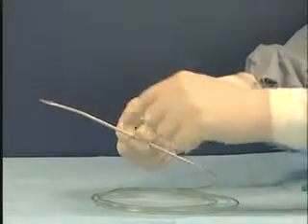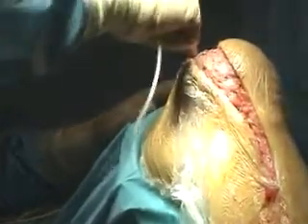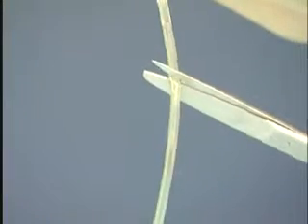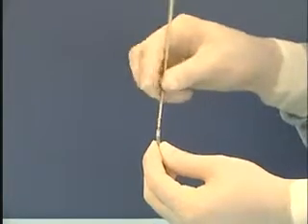We insert and pass the trocar wound tubing into the desired location until the black line indicators appear just outside the skin surface. We make sure that the section of wound tubing between the two black lines is not exposed at the surface. While using sterile scissors, we cut the wound tubing at a 45 degree angle for easier insertion in the wide drain connector.